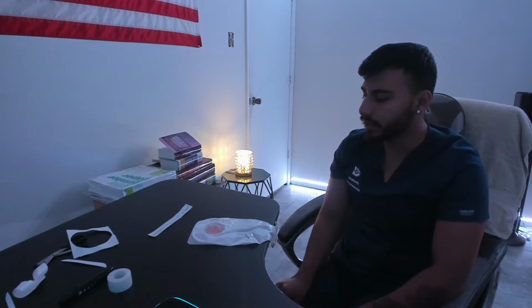Now, fast forward, I have orders to remove the ostomy bag. So the way I would remove my ostomy bag is I would first look at my orders. I would verify the right patient, the right date of birth, the right time. So I do have Jack Buzzard 6/20/19XX. Today's date, we are doing an ostomy removal.